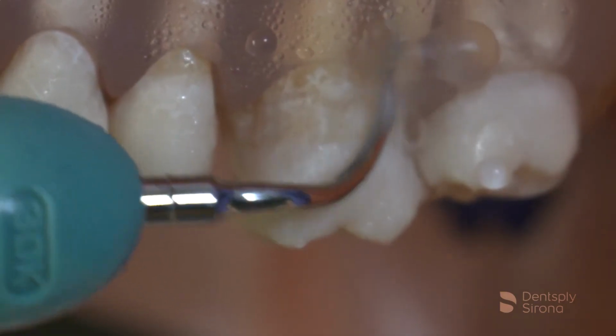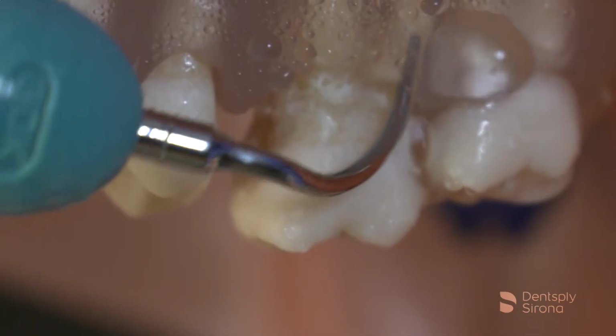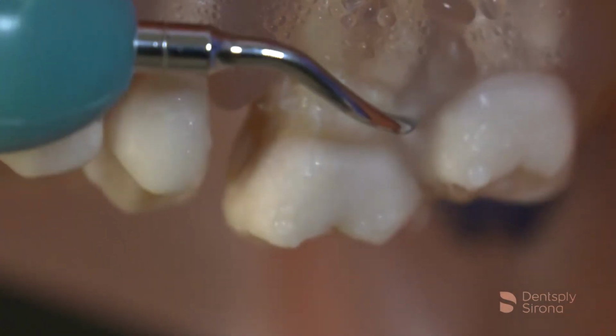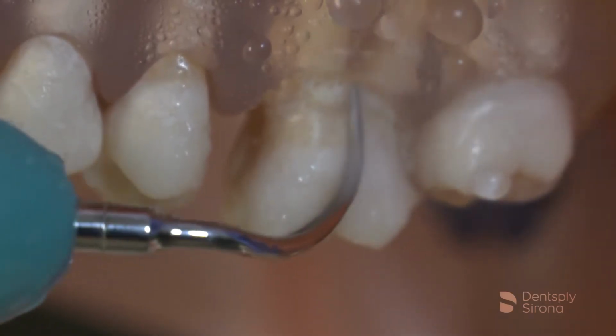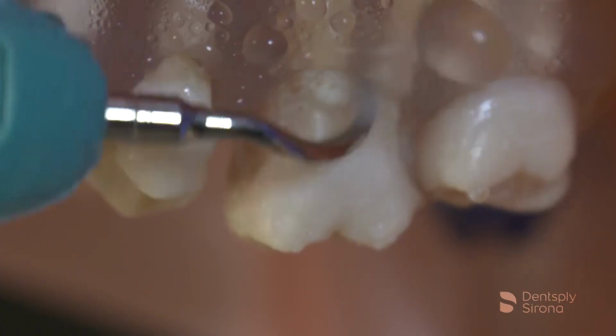As the clinician proceeds towards the interproximal area, proper adaptation is achieved by staying with the anatomy and following the topography of the pocket. Once thorough instrumentation has been achieved, the clinician returns to the line angle and with a vertical adaptation proceeds with a channel stroke across the buccal, allowing for tactile sensitivity to drive the stroke engagement.